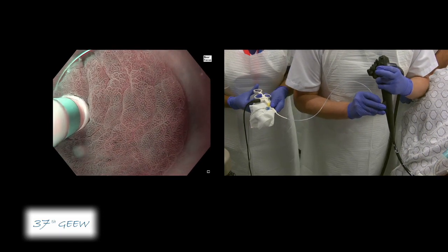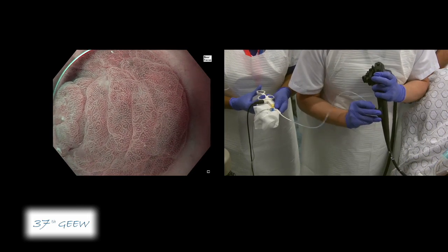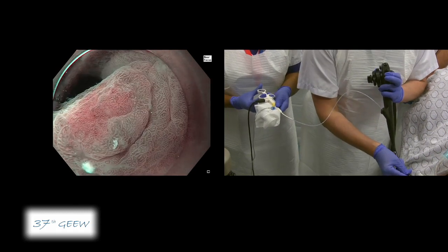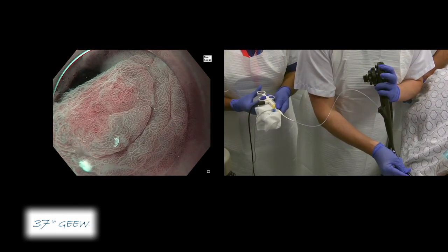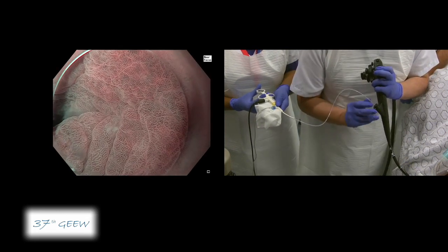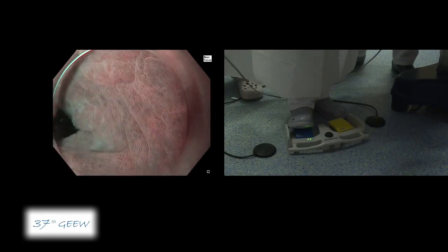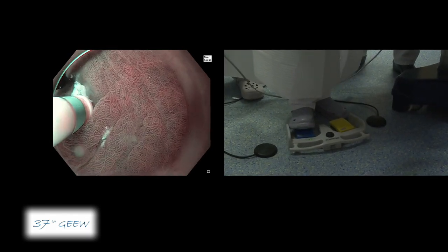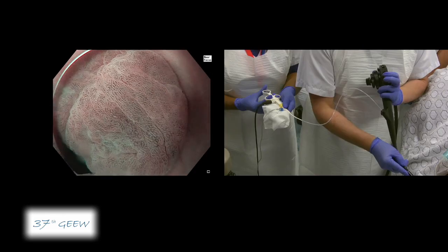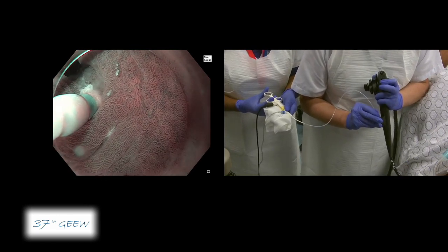You can see the normal background mucosa having a regular arrangement of surface structure — this is completely normal. But here it becomes completely abnormal and you can see irregular blood vessels. To avoid touching that area, I would like to place the marking dot here. The transparent cap is always very important to maintain a stable condition. It becomes quite close here, so I would like to put another marking dot just behind here.